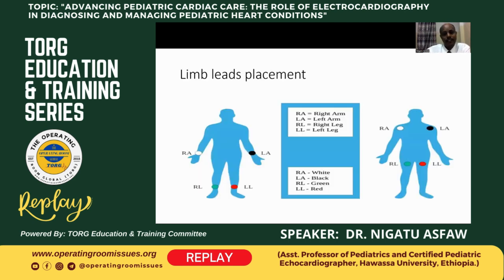And this picture shows where we can put the limb electrodes. So this is the right arm and this is the left arm.